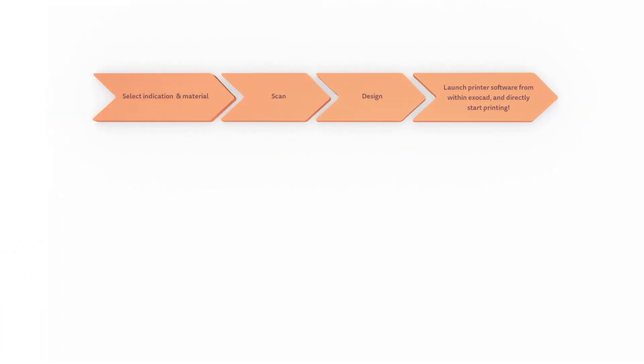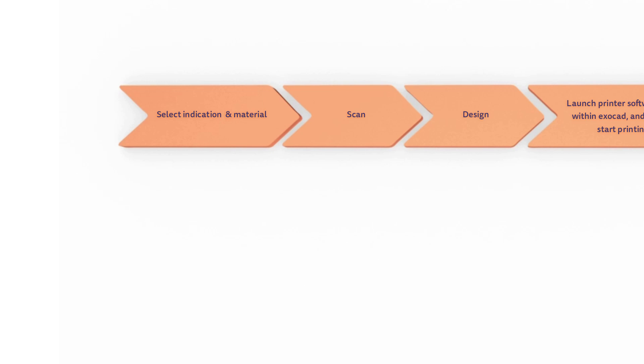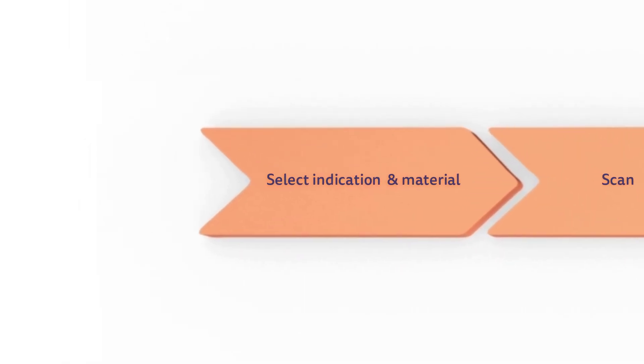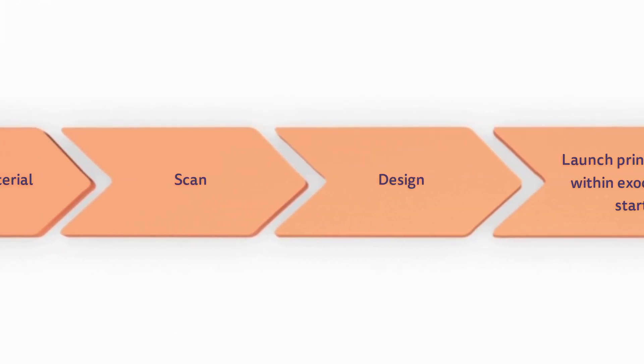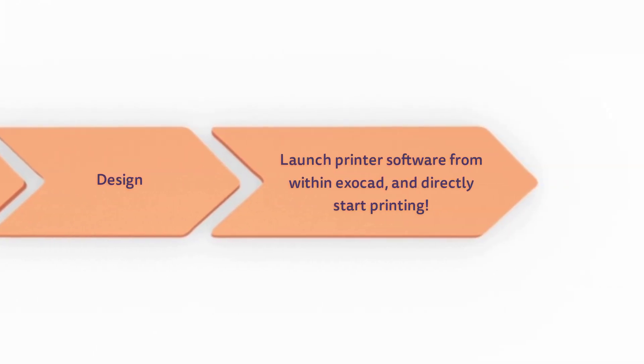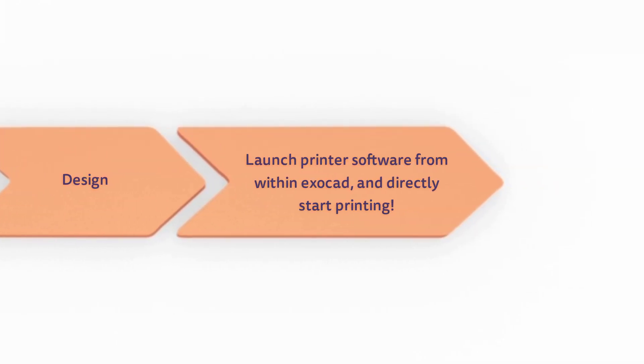The ExoPrint workflow is much simpler. After case setup, scanning, and designing, the printer software launches directly from within ExoCAD, and parts to be printed are automatically selected.